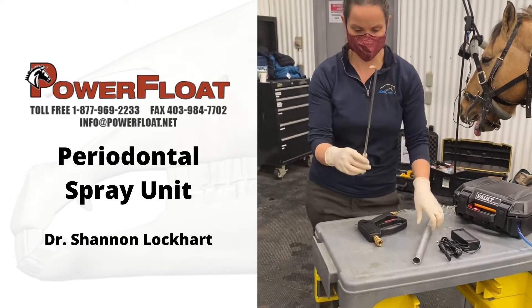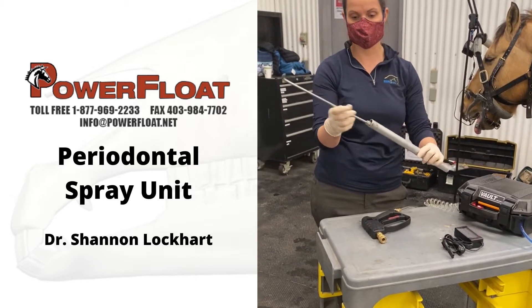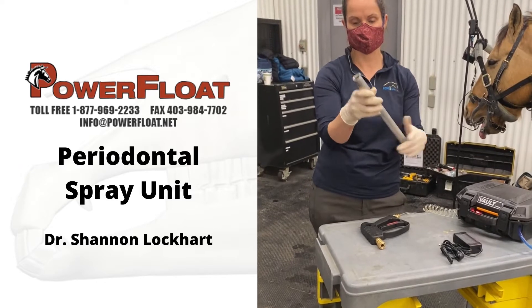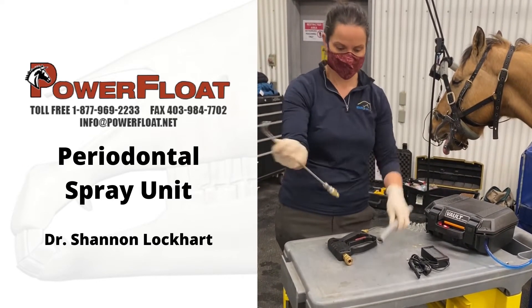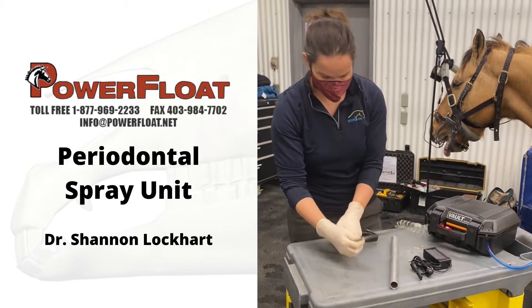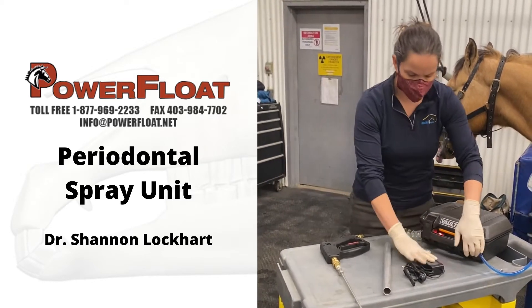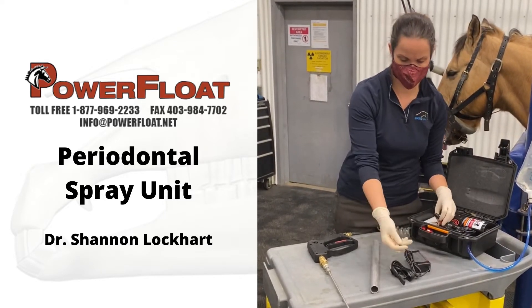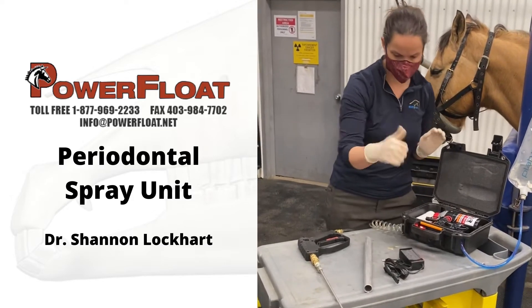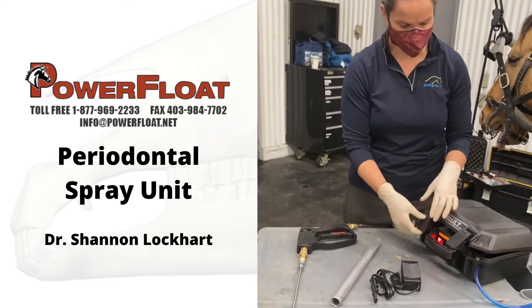This is the head that comes with it — it's detachable just for safety. When it's not in use, we just keep it in this sleeve to keep it from getting broken and bent when it's in the truck. It comes with a lithium rechargeable battery — just pop this off, pop the charger end in to the wall. Really easy to recharge. It just has a motor and a filter in there.